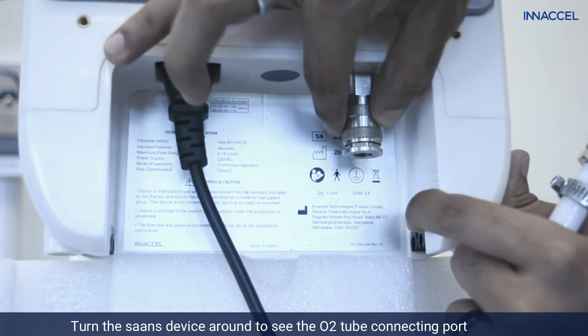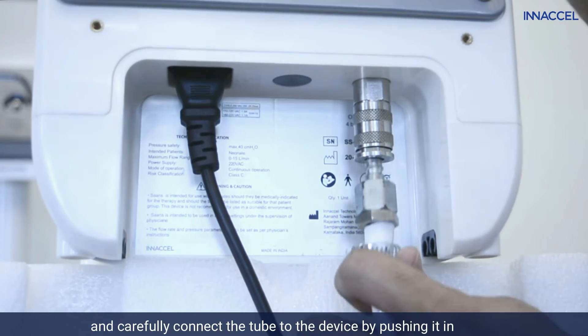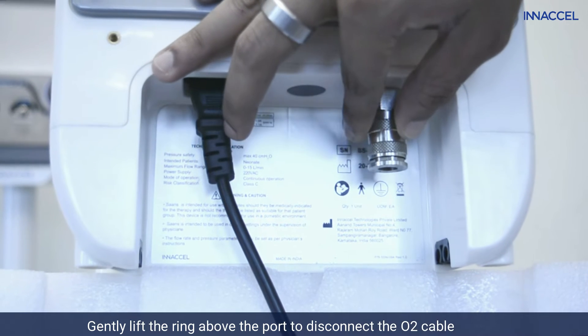Turn the Saans device around to see the oxygen tube connecting port and carefully connect the tube to the device by pushing it in. Gently lift the ring above the port to disconnect the oxygen cable.